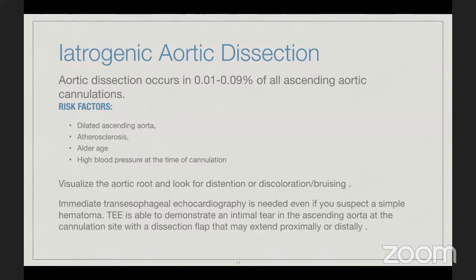Okay, so once you have a high suspicion of an aortic dissection, you should not continue with the same cannulation site. So if anyone asks you, especially in an exam, the first thing you have to say in such a situation is, I have to ask for help. So you will call your colleagues and inform everybody in the room, I am suspecting that I have a dissection. So everybody is prepared, because now you are in a simple CABG and the situation has changed to something else. So you have to call for help, inform everybody, and stop the pump. Stop the pump. And then you have to decannulate your cannula and secure the purse string while your assistant is preparing the groin for emergency femoral cannulation.